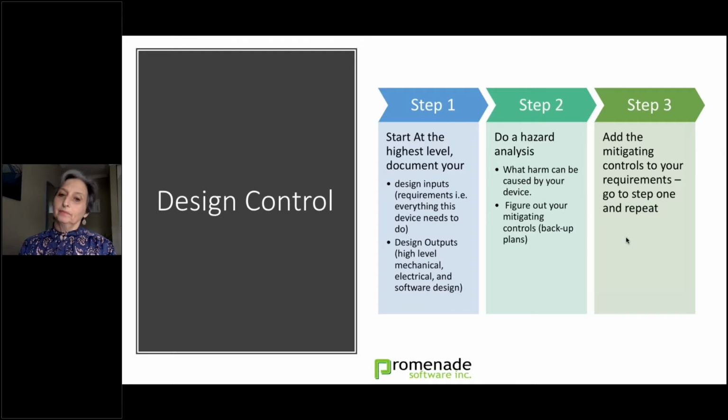The next step is, well, let's go back to step one. Having here the design outputs. At the high level, at least, understand your overall system design, what it is you're looking at, the high level. Then you can do a hazard analysis.